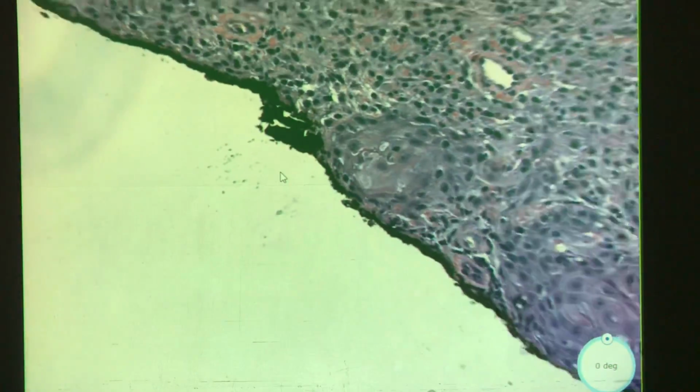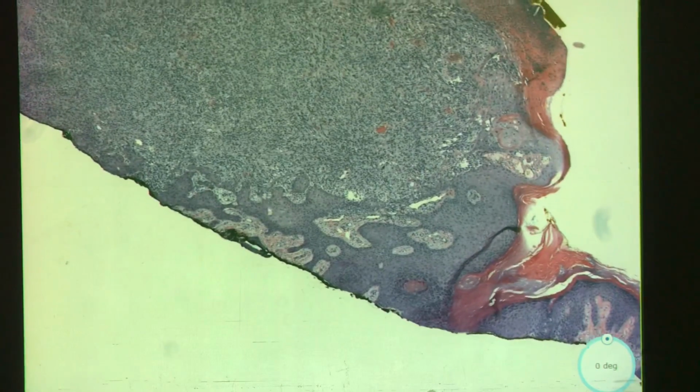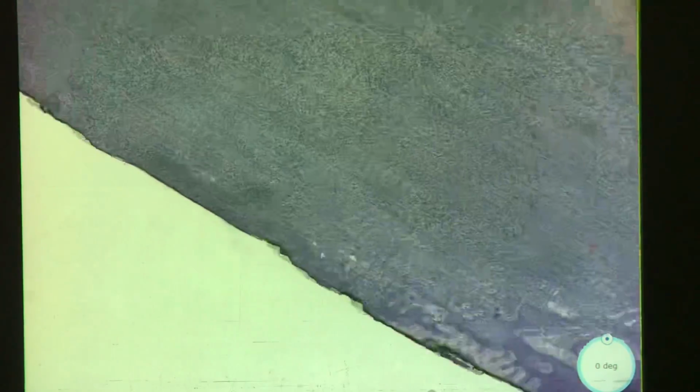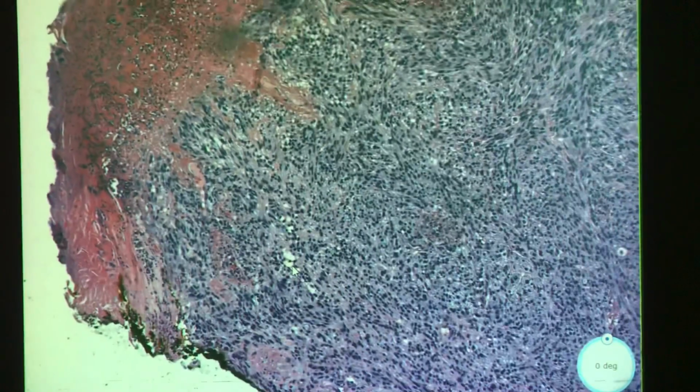It's weird, but I don't know. We don't see much. It's on the ink, so they're going to need to go back and revise that. Oh wait, no. Oh, this is just weird. Okay, I think it just kind of folds in the epidermis. Kind of looks like it's doing that cuffing thing. Forgot the name. Oh, the collarette. Yeah, that's sort of it.